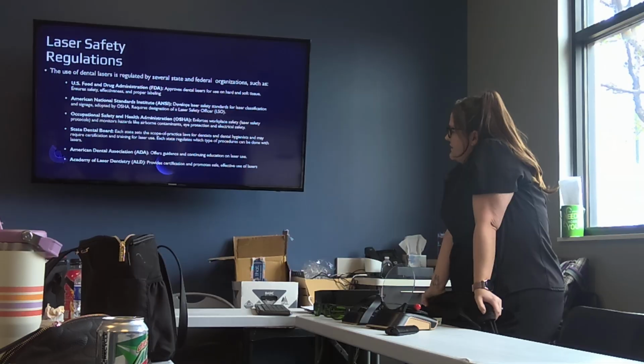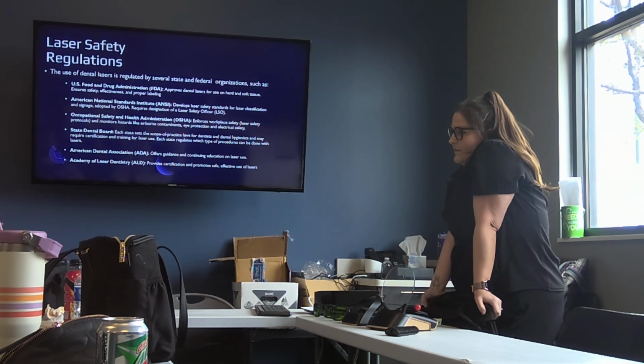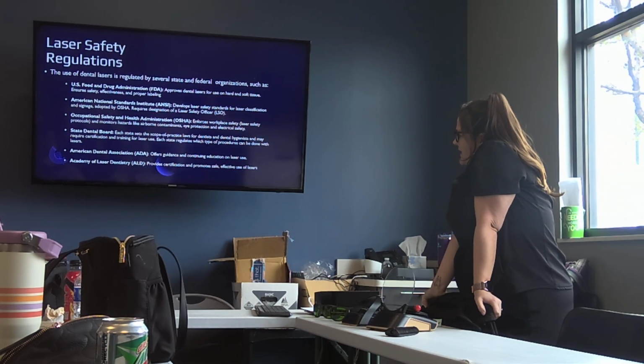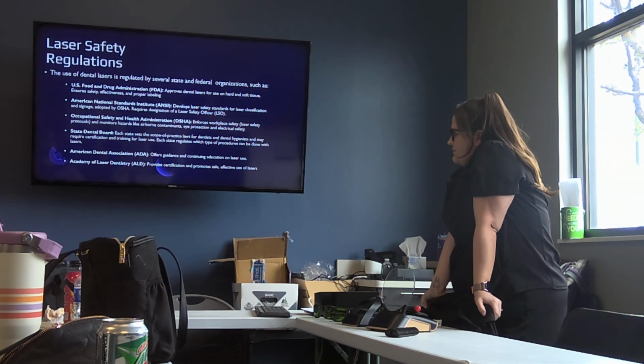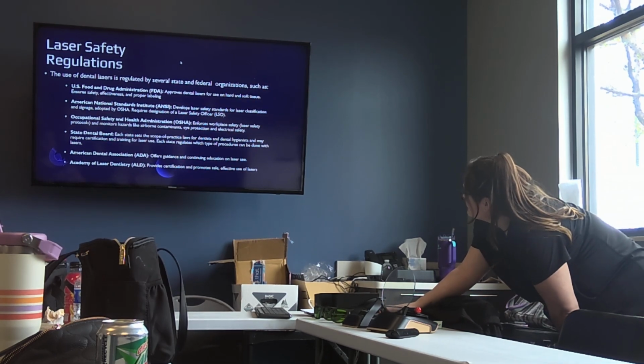And then the ADA, the American Dental Association, offers guidance and continuing education on the lasers. And then the ALD provides certification and promotes the safe, effective use of the lasers.